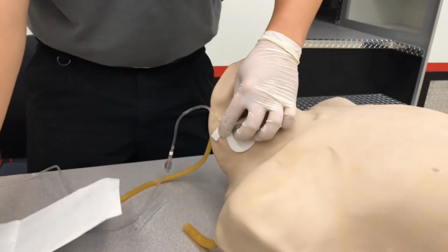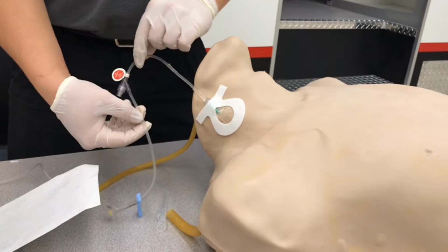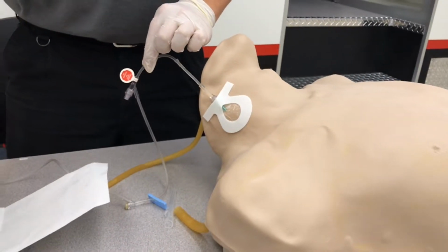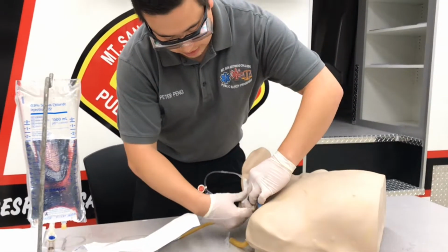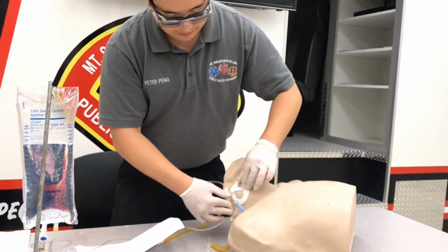Now when you're securing this, you want to wrap this part around the patient's ear. That way you've secured it, and you also have access to this port if necessary. So that'll go around the ear, and then we will tape it again back here at the base of the neck. Now reassess the patient, and you're all set.